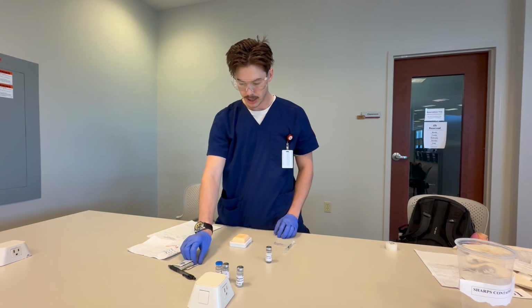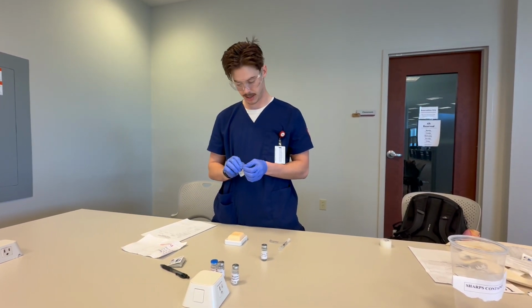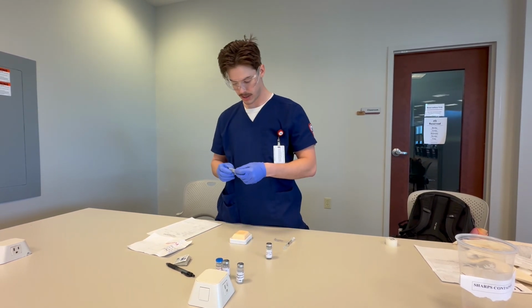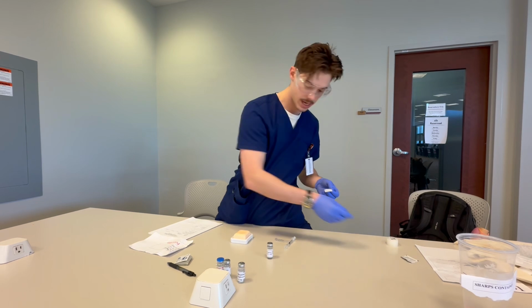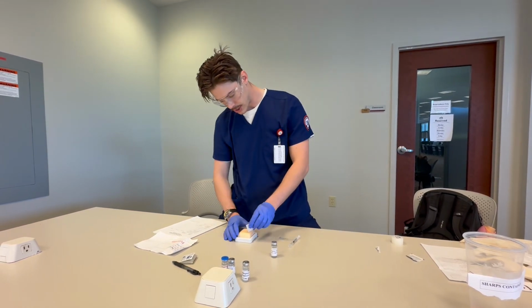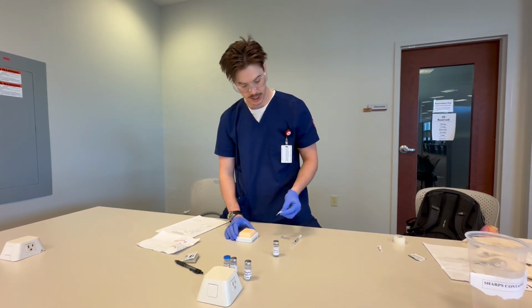All right, hello, Mr. Jones. I'm going to be giving this in the abdomen. On a subcutaneous injection, first I will swipe at the middle, going around the edge.